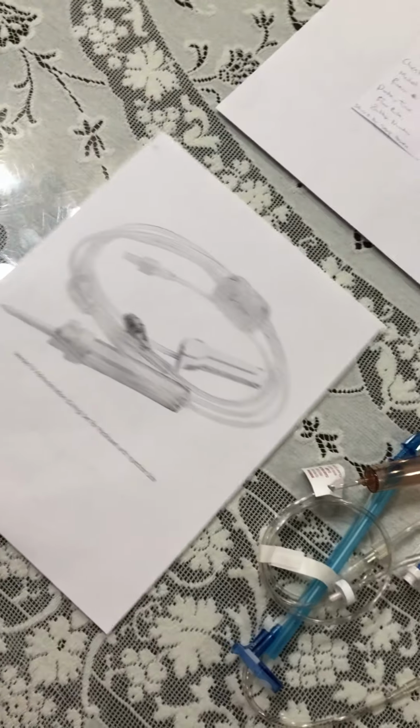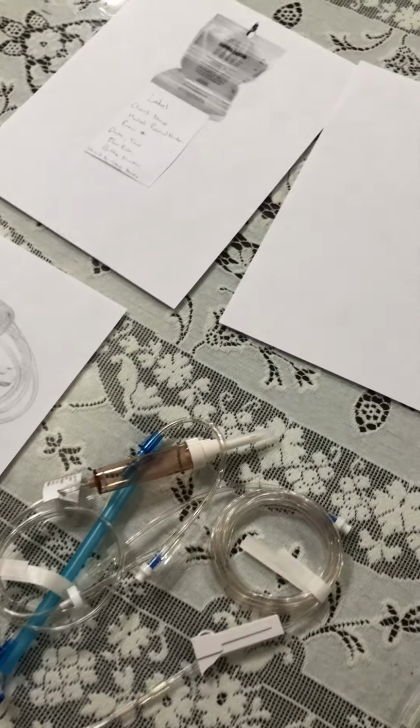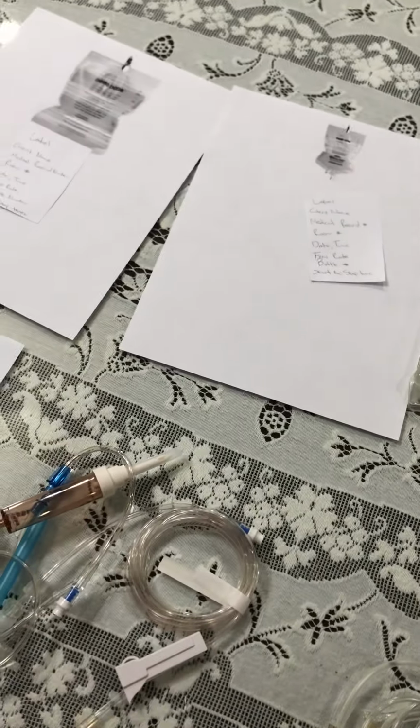So I'm going to use a special inline filter with my TPN, and I want to prime that. Same thing with my lipids. I want to hang that, prime it, hang my D10 and prime it, just in case.